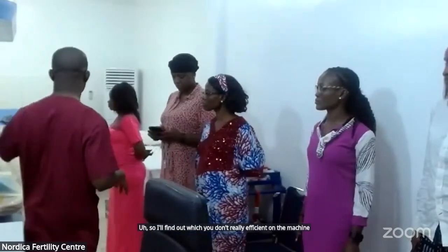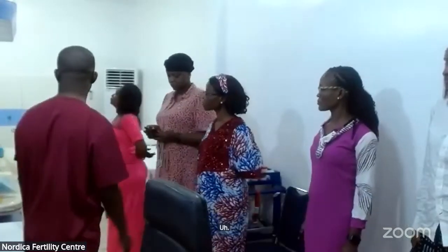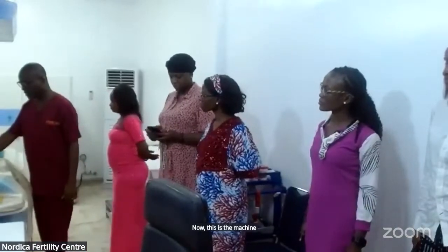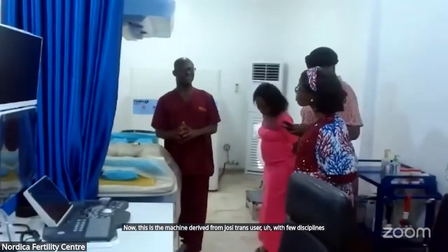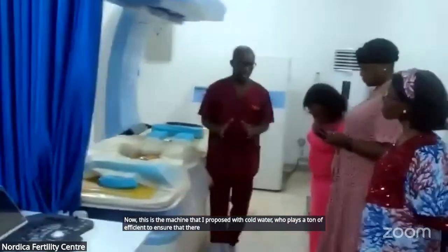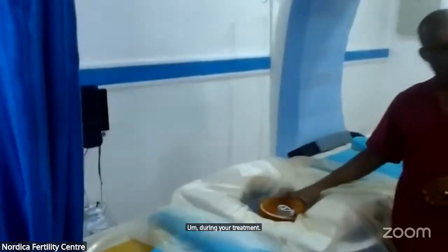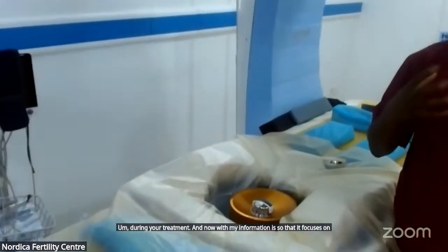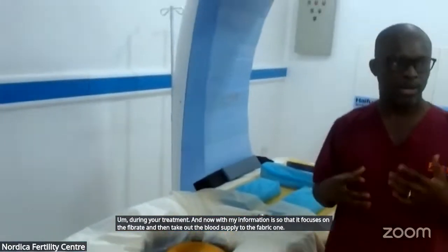The patient lies face down, head to this side, feet to the lower part. This is the machine that I control, the transducer. We fill this plate with cold water and place the tummy of the patient on it to ensure that there is no skin injury during the treatment. Then we manipulate this to focus on the fibroid, and we take out the blood supply to the fibroids one by one.